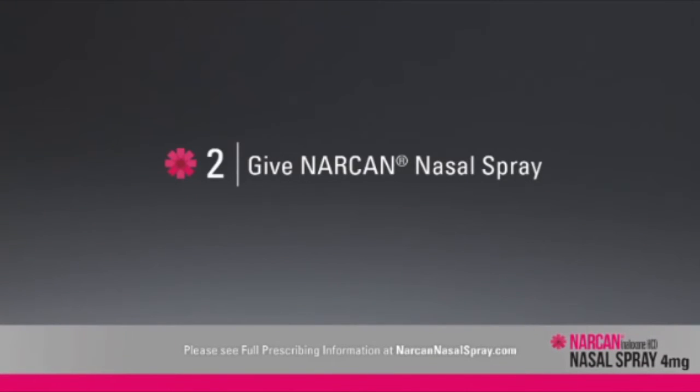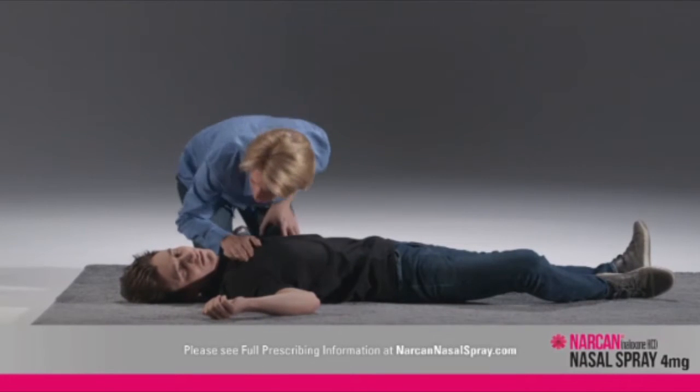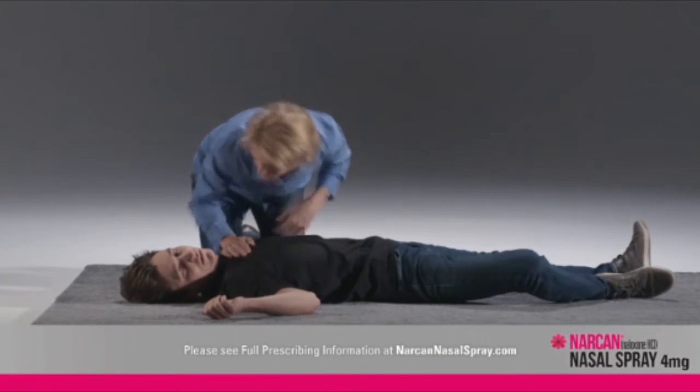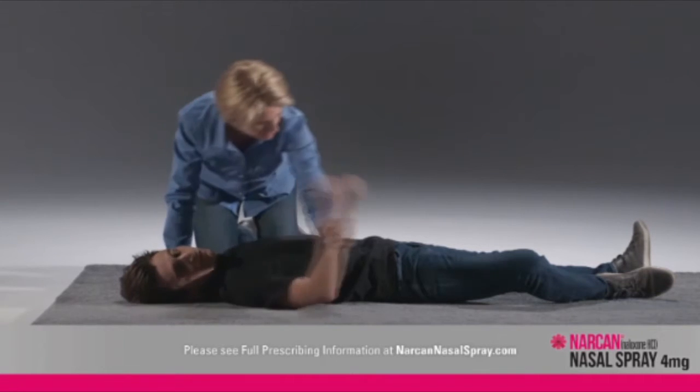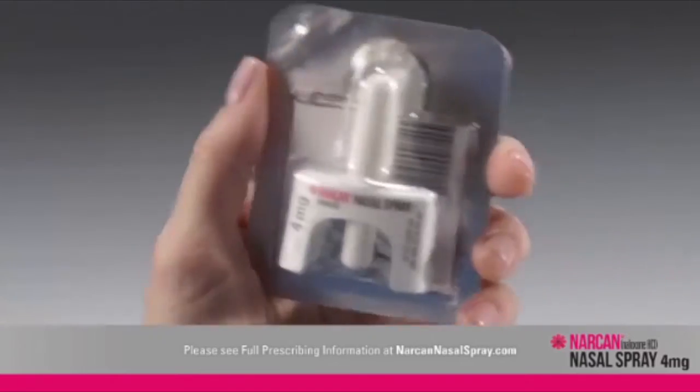Administer Narcan nasal spray as quickly as possible if someone is unresponsive and an opioid overdose is suspected, even when in doubt, because prolonged respiratory depression may result in damage to the central nervous system or even death. Lay the person on their back to receive a dose of Narcan nasal spray.